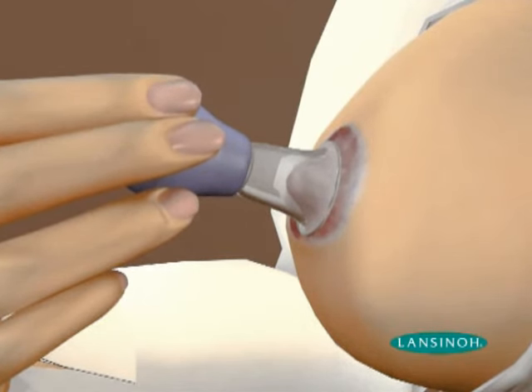The Latch Assist helps temporarily evert the nipple, which must be drawn back to the roof of the baby's mouth in order to establish a good and comfortable latch.